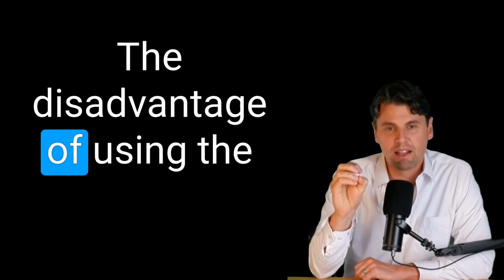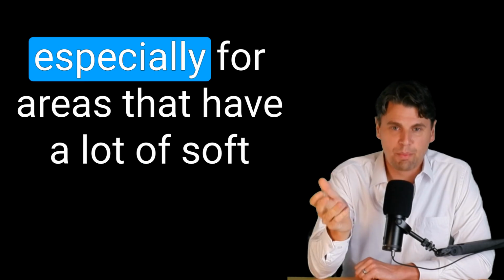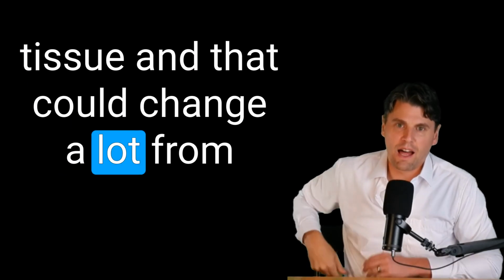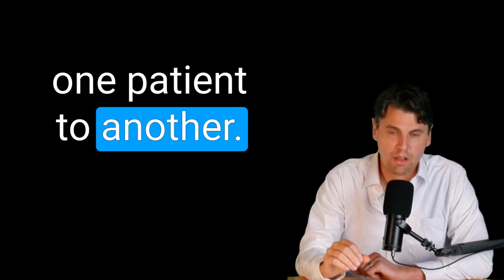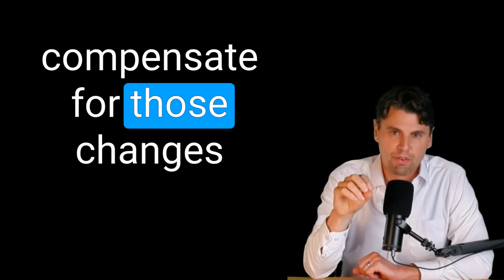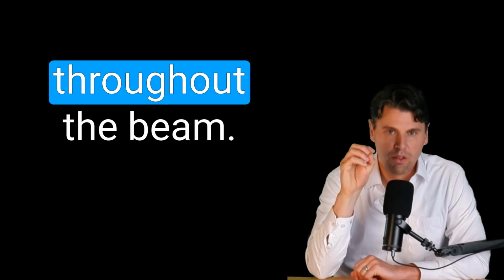The disadvantage of using the fixed KVP is that you cannot compensate, especially for areas that have a lot of soft tissue and that could change a lot from one patient to another. If you're using a fixed KVP, you can't compensate for those changes in the total attenuation throughout the beam.